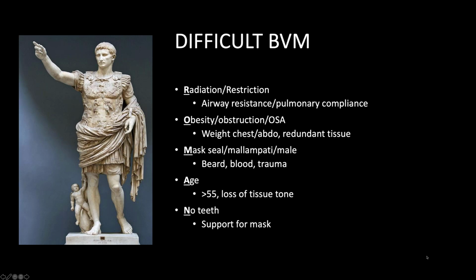Is there any resistance to mouth opening or radiation to the upper airways that may make deploying or providing positive pressure ventilation difficult? Is there any issues with pulmonary compliance that will make distension of the lungs difficult?